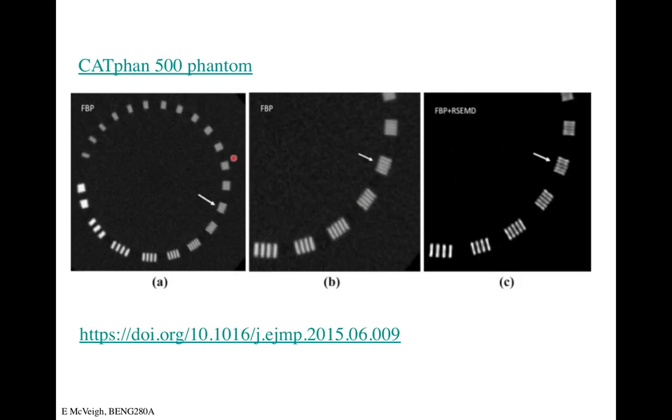Phantoms are designed such that you can just put them in there and measure directly what the spatial resolution of your system is. And this is one you can buy for, I don't know, $1,000 or something. It's actually probably more than that. But these will be high contrast objects. Usually they're not metal, because metal gives you a huge amount of attenuation. You need something less than that, so it's some kind of plastic, and it can be embedded in either air or water.